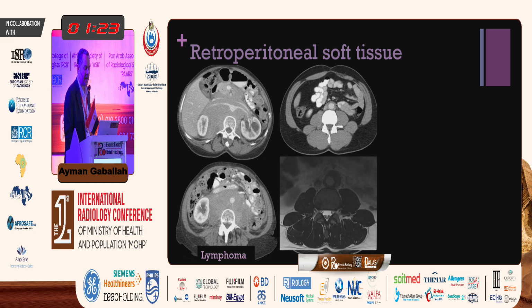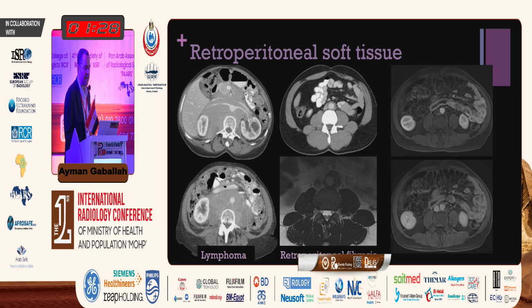And the second case is retroperitoneal fibrosis. And the third case was an IgG4 related disease.